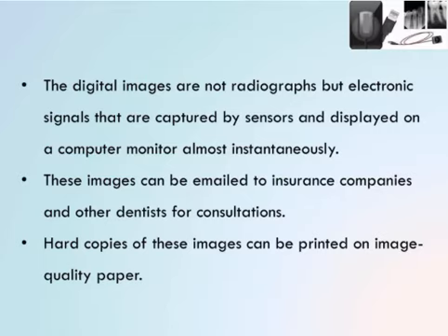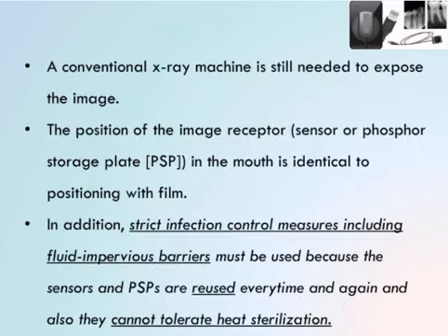We need not save a paper file and a hard copy. We can always save a copy which is stored in the archives of the digital imaging system. Archives are storage spaces inside the computer or in the system which we use for storage of large data.